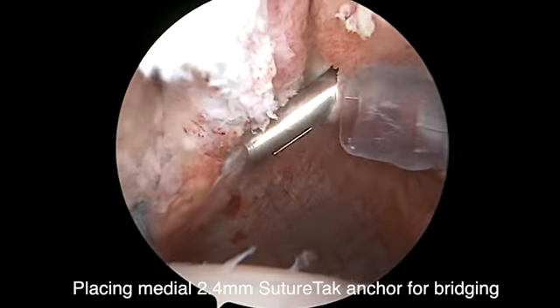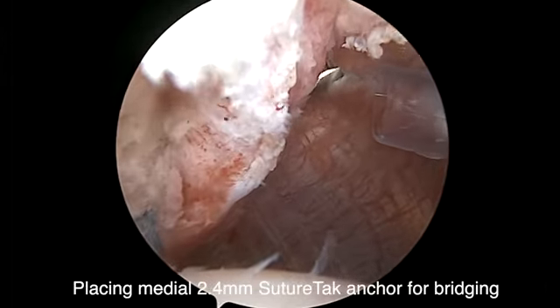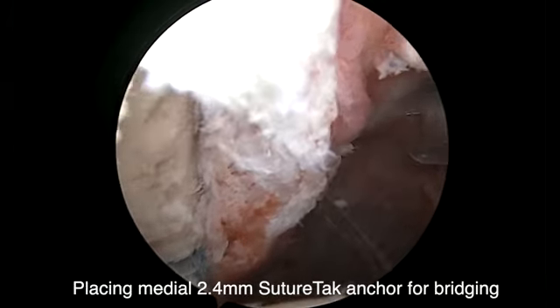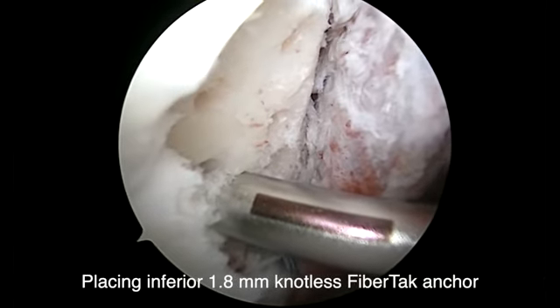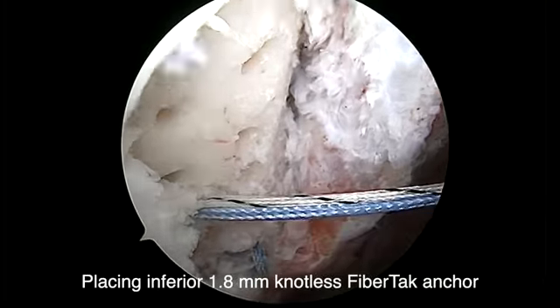Next, a drill guide for the 2.4 suture tack anchor is inserted through the initial posterior portal and drilled medial to the bony Bankart lesion into the non-articular surface of the glenoid. The drill guide is then translated laterally around the lesion. A 1.8 knotless fiber tack anchor is then drilled into the articular margin of the posterior glenoid.